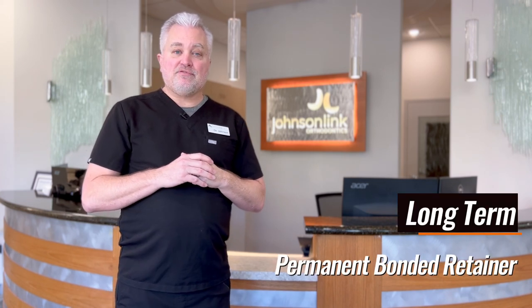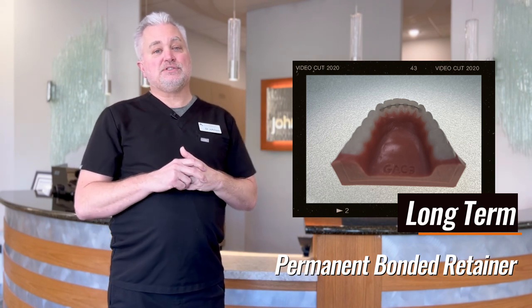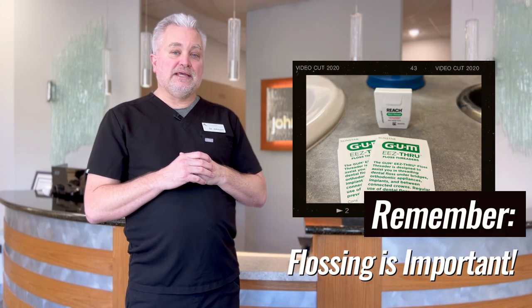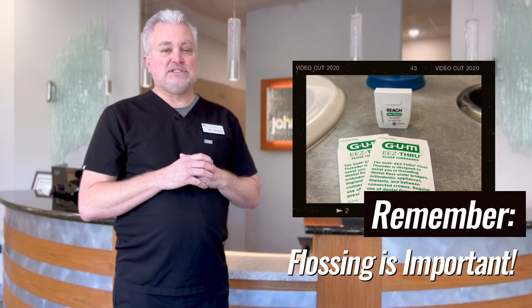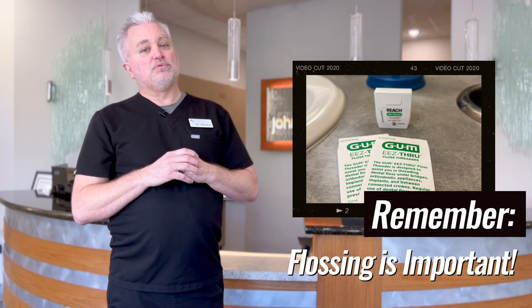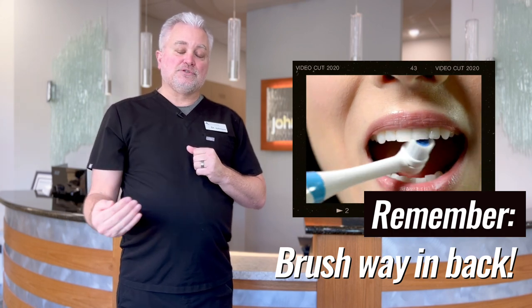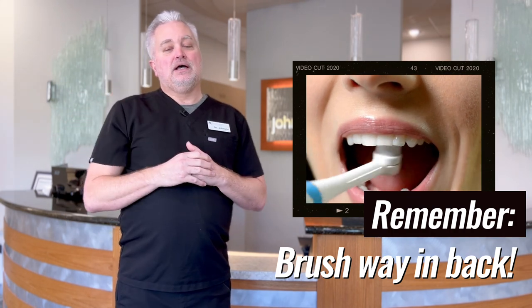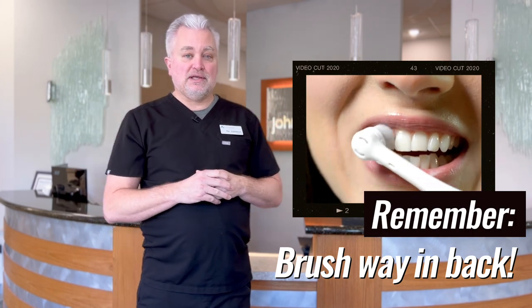Some of you will have permanent retainers, also called bonded retainers — these are little wires glued to the back side of your teeth, usually the lower front teeth. You don't have to wear those because they're on there all the time, but they do need to be taken care of. Flossing is the most important thing: thread the floss underneath that wire — we show you how to do this at your appointment. Make sure you also brush that retainer; if you're using an electric toothbrush, hold it back there for about 10 seconds as part of your routine.